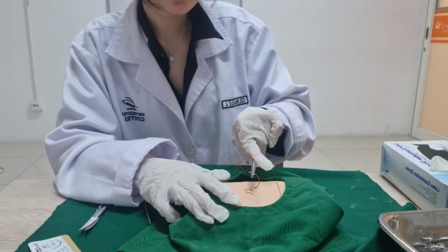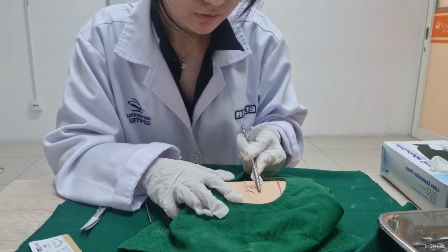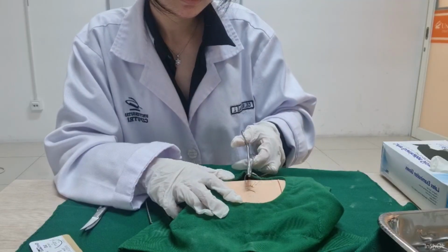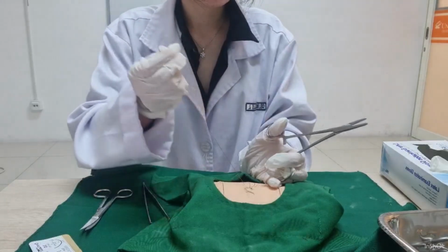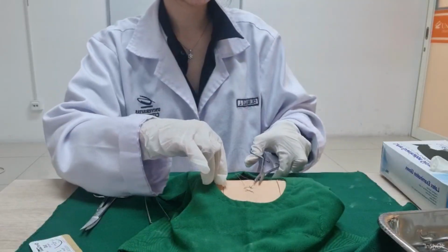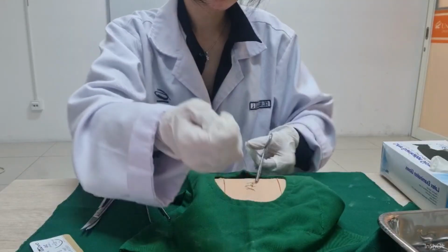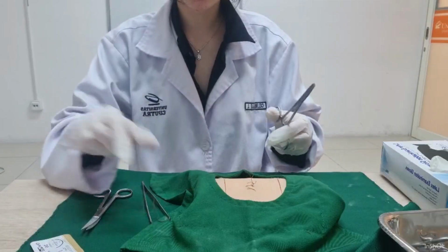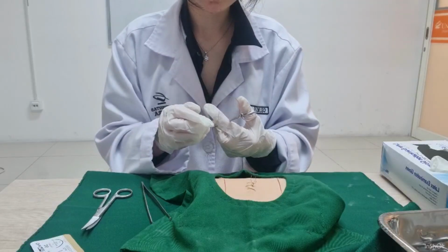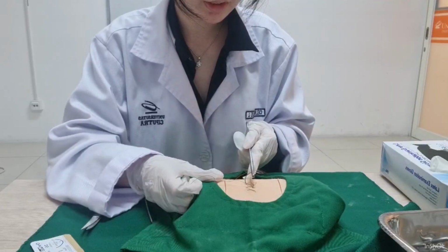Okay, so I will insert the needle into the wound at a 90-degree angle. Okay, so I will tie the first knot. And after this, I will continue suturing. I'll start suturing now. So I will continue at the other side and make sure that the suture is even.